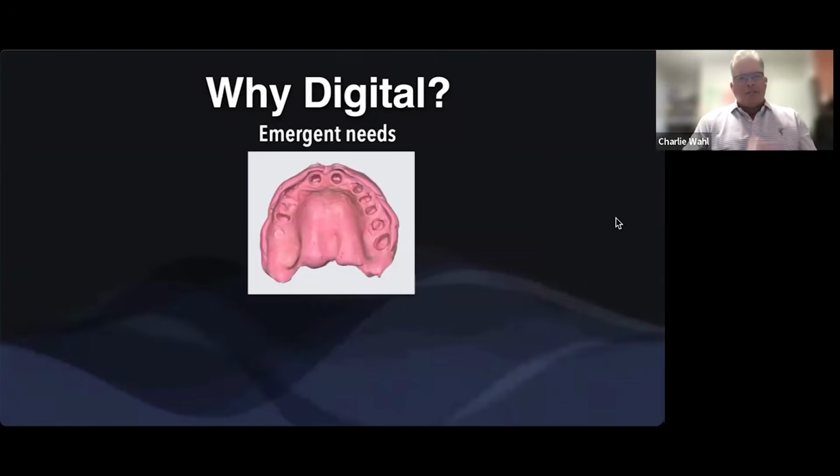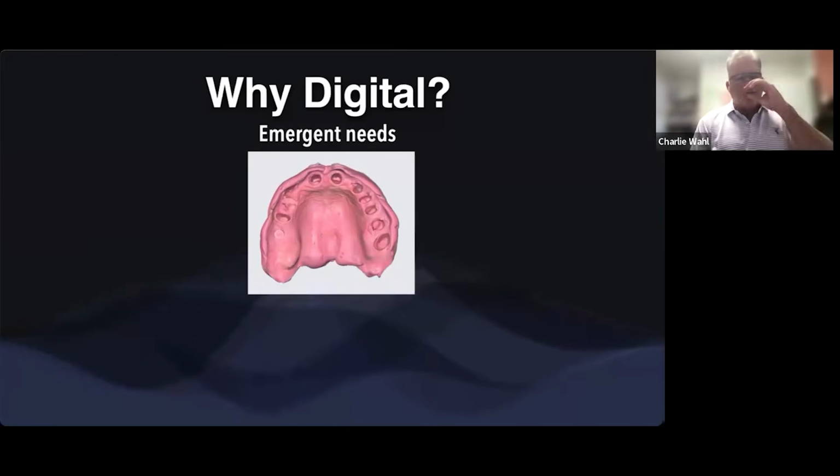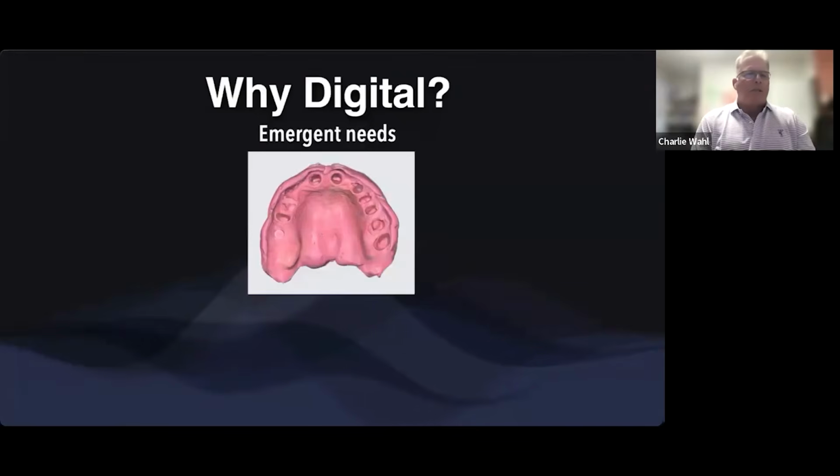Sometimes in dentistry, we have emergencies, right? We try our best to block schedule and schedule for production and schedule blue time and all those things. And sometimes we have patients that just don't agree with that concept, or at least I don't. Just like other dentists, this was a dentist that we were doing some lab work for. This patient had failing crown and bridge, and the patient came in, broke part of it, and a provisional was made.